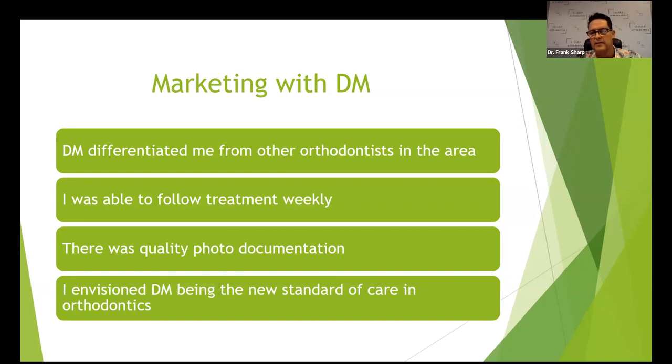And then we are allowed to send out any message that we want to the patient as well, as far as encouragement. Hey, you need to brush better here, et cetera.